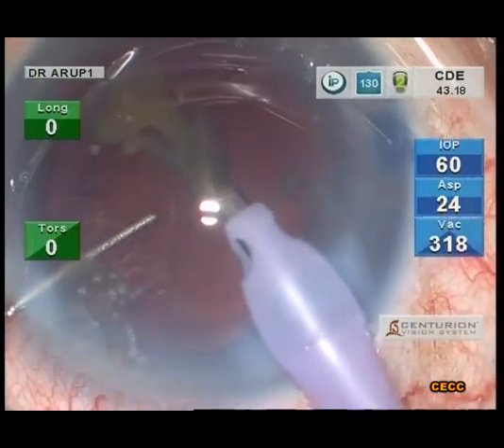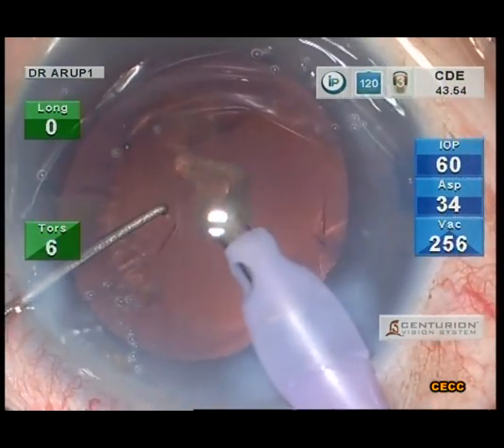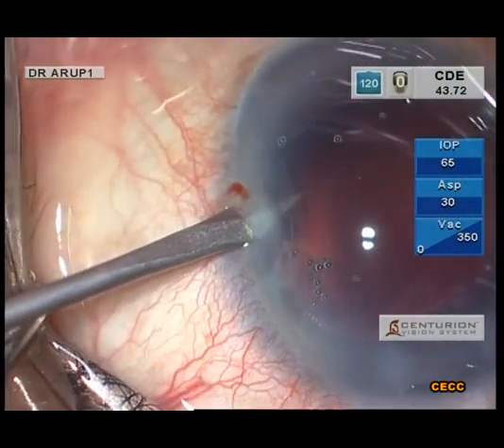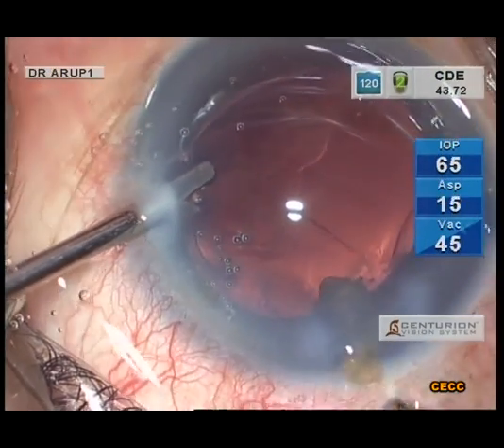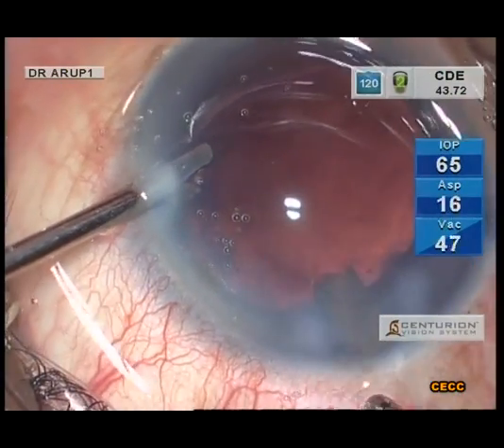Not much residual cortex is left if a proper cortical cleaving hydrodissection is performed. Throughout the surgery, just a Sinskey hook was used for nucleus manipulations at various stages. In the subsequent videos in this series, we will demonstrate the use of dedicated choppers.